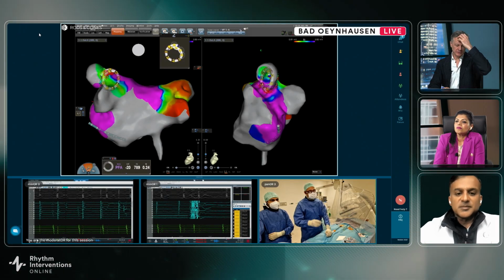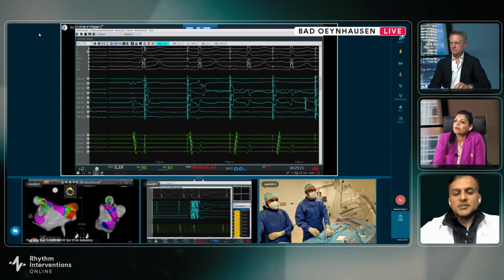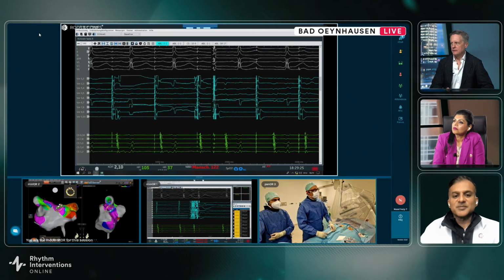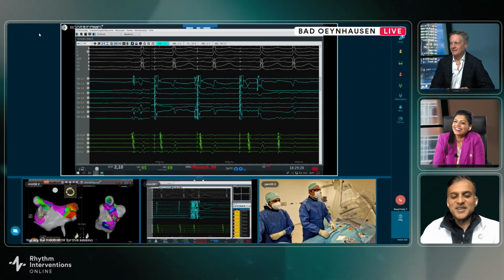And Devi, what's your experience of this? I'm deliberately slowing you up, Krishnan. You're too quick. As well. Yeah, it's good. We're just doing remap.